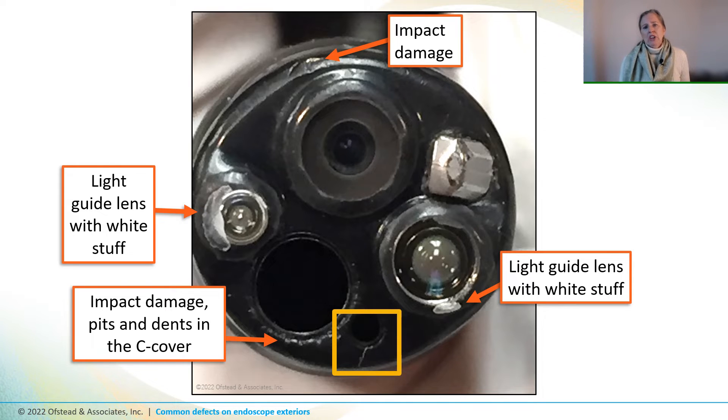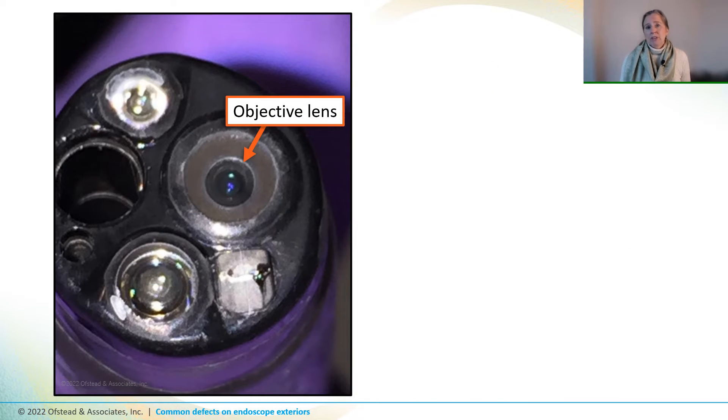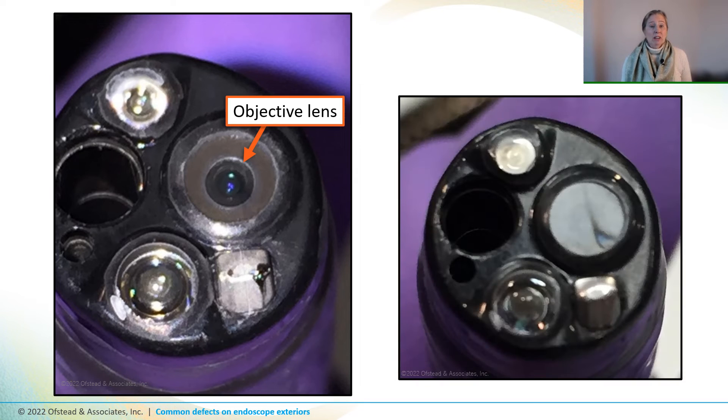My colleague John also thought that the objective lens might be cracked. So we looked at it from various angles and could see that the lens was indeed cracked — and it actually looked like a chunk was missing. This is a bad defect because fluid could get up under the lens, damaging the scope and harboring germs. Sometimes defects like this are noticed because the lens fogs up and the image gets kind of fuzzy during procedures.